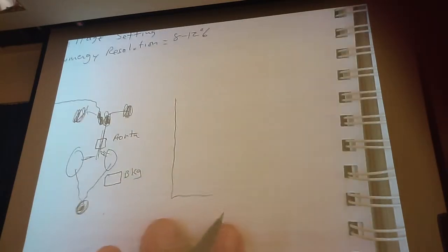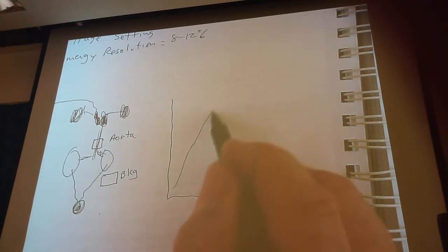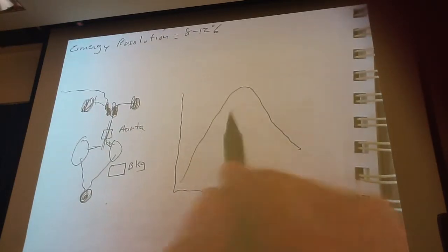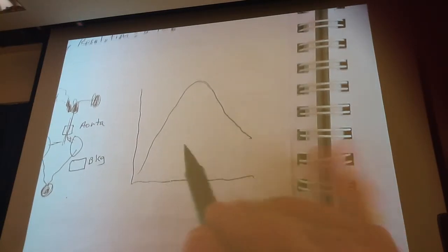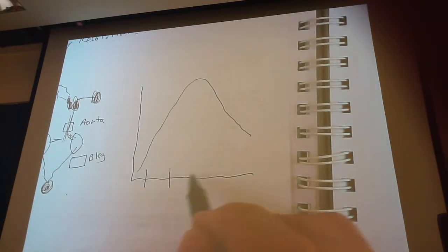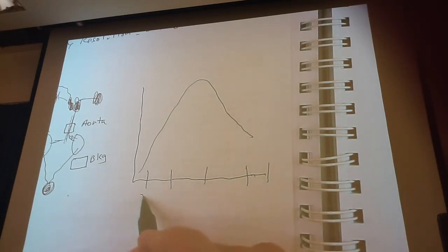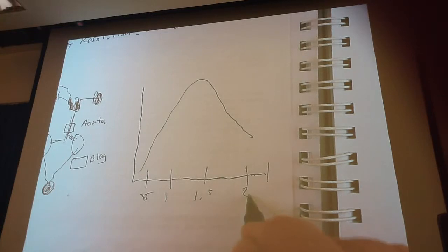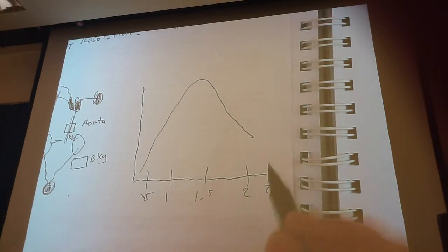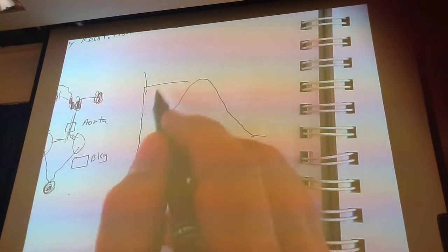Okay, if you look at your aorta curve, you're going to get the blood arriving, and then something like this. And then down here you have the time. So let's say that each one of these represents half of a second. So here's 0.5, here's 1, 1.5, 2, 2.5. Okay, so again, you look at the peak.